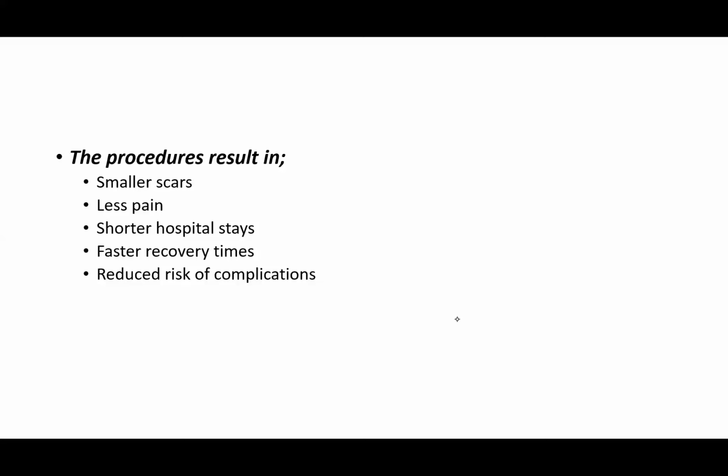Now, it is interesting to note that laparoscopic surgeries are done under magnification. The image you are seeing is a magnified image where you see structures clearly outlined.